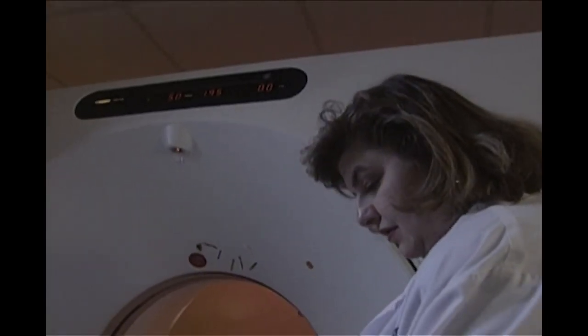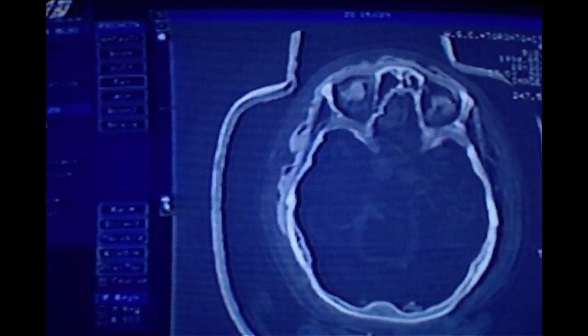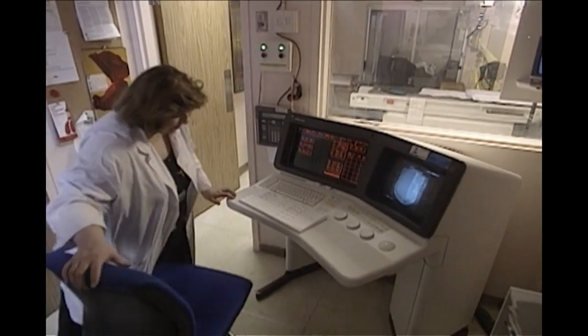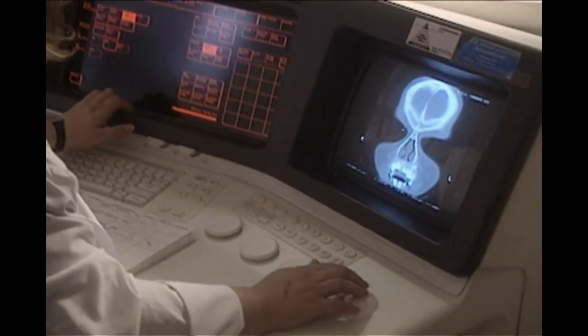Because the patient was already dead, Holoka didn't need to worry about radiation levels. That freedom enabled her to take numerous pictures at very small increments. She scanned the body in 5 millimeter slices and went to 3 millimeter increments for the head and neck. Even greater detail was used to image the ears and eyes. 300 two-dimensional images were taken during the 4 hours of scanning. Glimpses of Jed came through in these X-rays, but it wouldn't be until they were stacked together that the ancient woman would truly come to life.